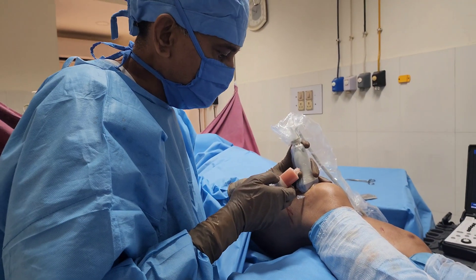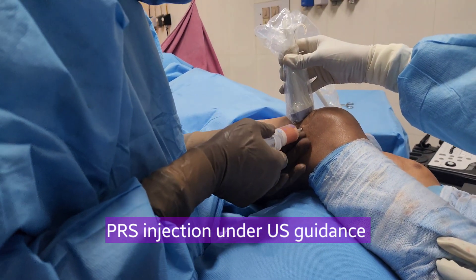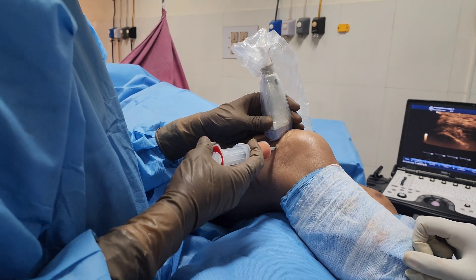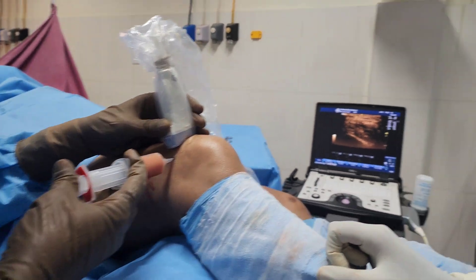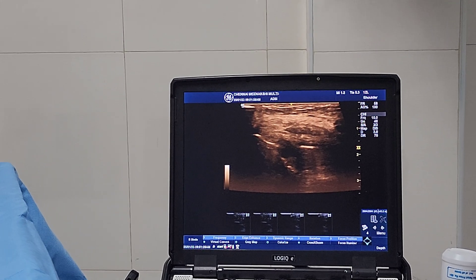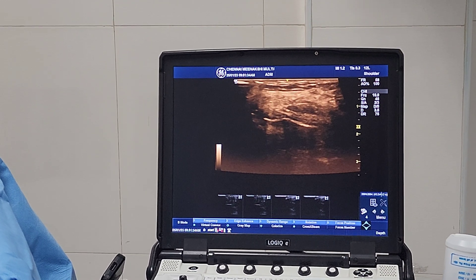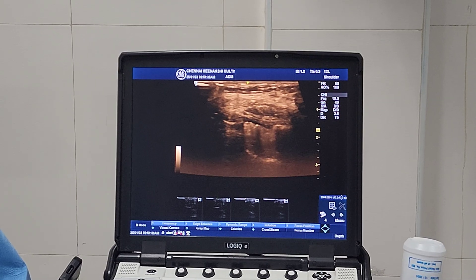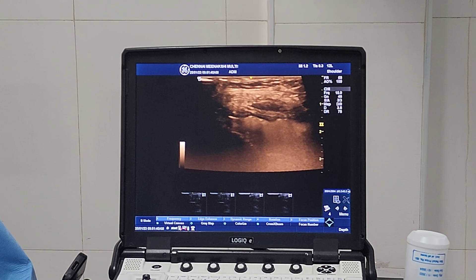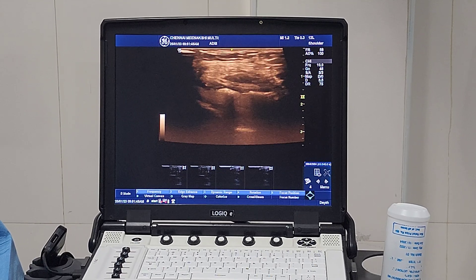Under ultrasound guidance, the needle is already there in the joint. I am connecting this SVF syringe and making it tight. I am injecting the SVF. You can see the joint distending with the SVF. Went in easily. Finished.